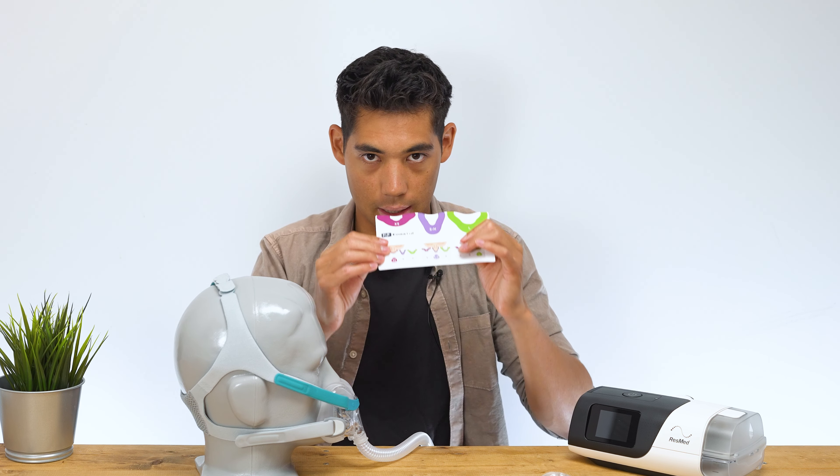Alright, I've put the mask on — you can see how magnets would be easier in this scenario because I don't have a mirror on set. As you can see, if the pillow is here it kind of goes forward rather than being wide and hitting the side of my face. It fits pretty well — it's very secure on the face and head, despite the straps being a little further back. Overall it's a very secure mask and does a really good job getting air in. Just the ergonomics outside of bed could be a little better. If you go to bed and sleep lights out and wake up in the morning to take it off, this could be a really good mask for you.